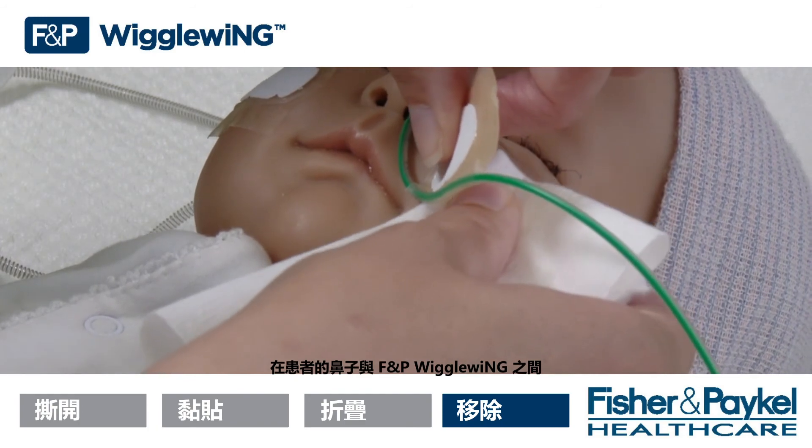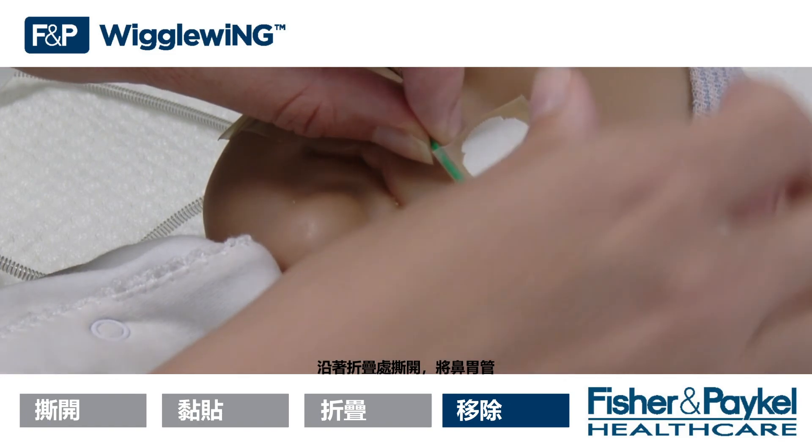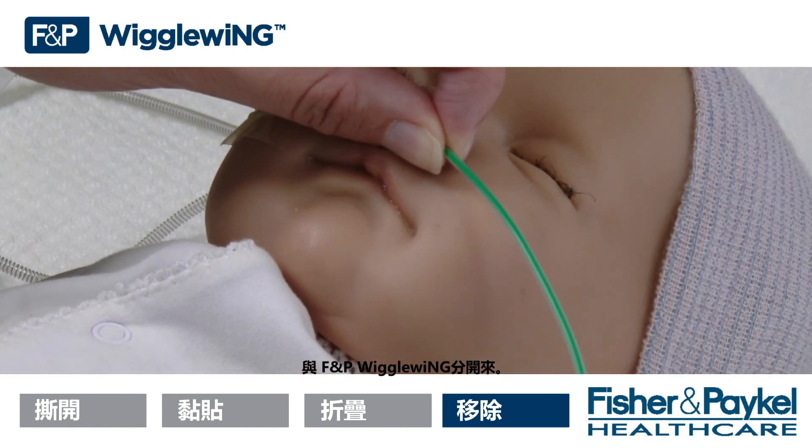Holding the NG tube securely between the patient's nose and the FMP Wiggle Wing, detach the NG tube from the FMP Wiggle Wing by tearing along the perforations.